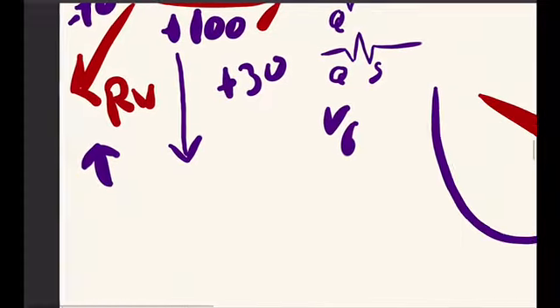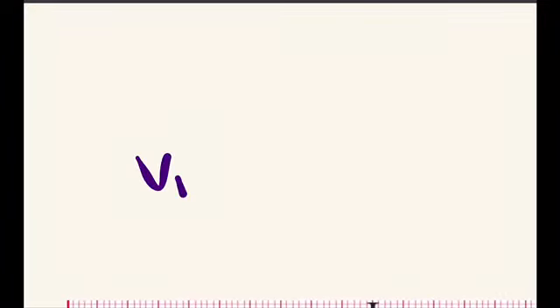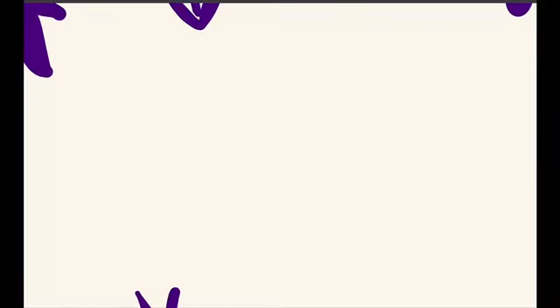What will happen to the V1 lead? Talking about the V1 lead, normally there is an R wave. Why can the R wave be seen? The R wave is because of the septal depolarization, as the vector is going towards the V1 lead. The second part is the S wave, and the S wave was more negative as the vector was going away from the lead. So now what will happen? Think, guys.